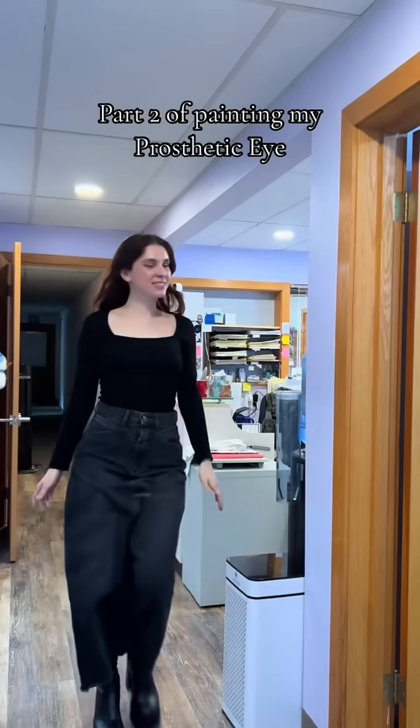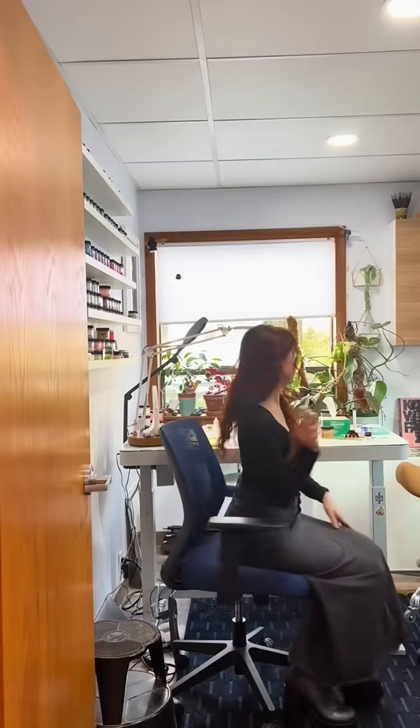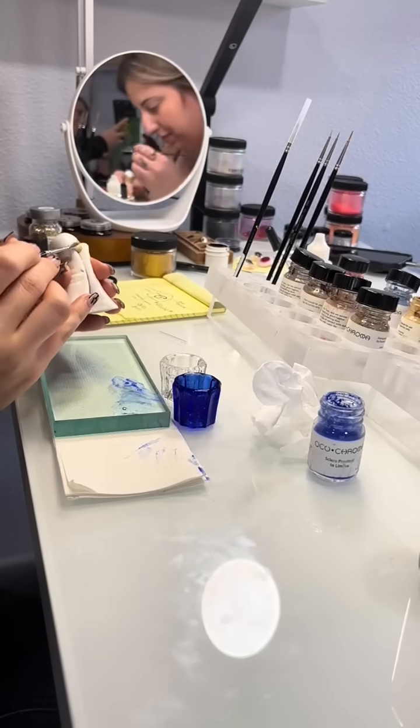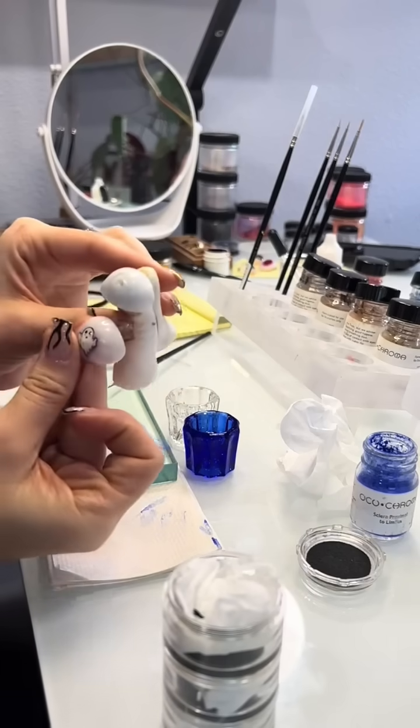Part 2 of painting my prosthetic eye, and if you remember from last time, I painted my sclera way too blue. There are no erasers when it comes to making eyes, so Christina had to buff the whole thing clean and I had to start all over again. Now my second go round was way better because I watered down the pigment a ton more so that it barely showed up, and I was able to compare it to a prosthetic that has a very good match of my sclera, and it looked pretty solid.